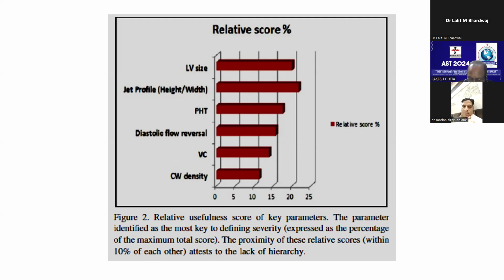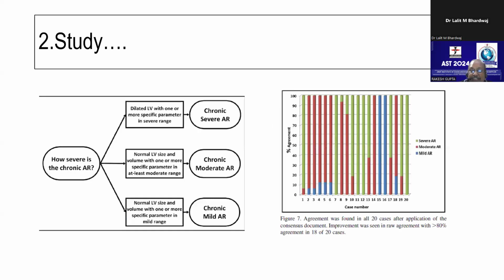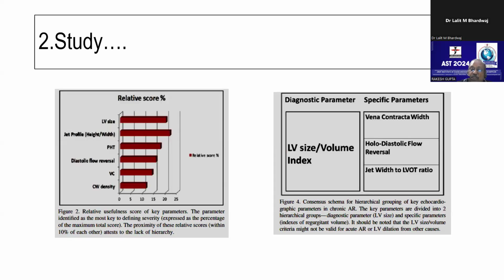And this is a paper published in 2013 saying that 20 cases were sent to 20 legends in the world who were doing echocardiography to assess the severity of AR in those 20 subjects.